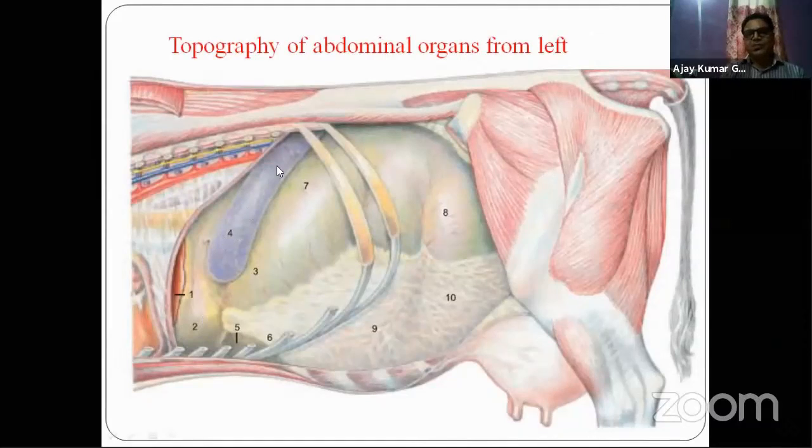The spleen is located between the 7th to 12th intercostal space and has an oblique position. The rumen occupies the remaining left side abdomen, and the spleen is between the abdominal wall and the rumen. At the ventral part of the abdomen, just caudal to the xiphoid, lies the abomasum.